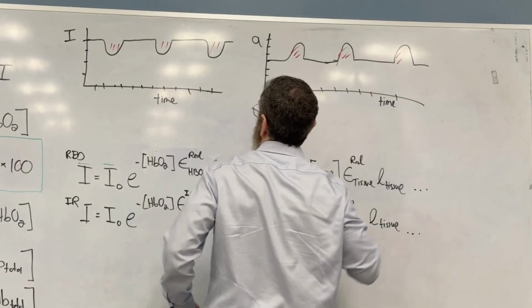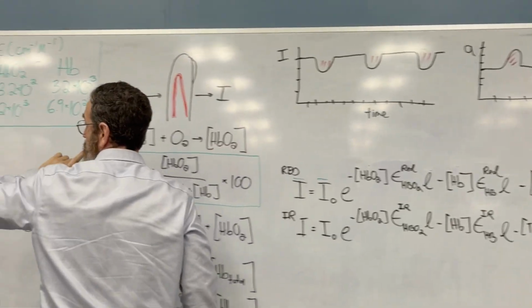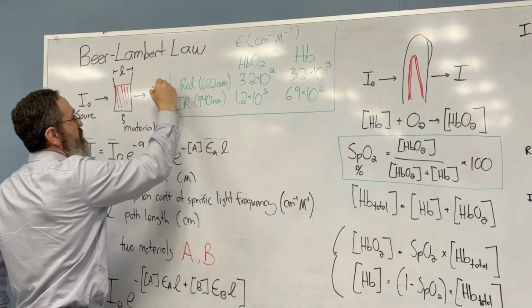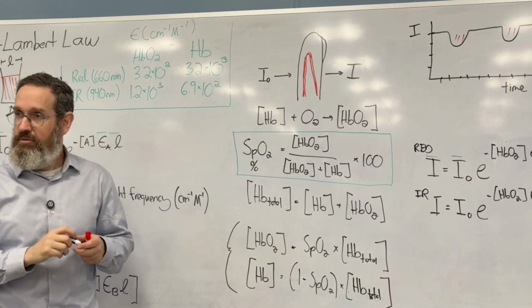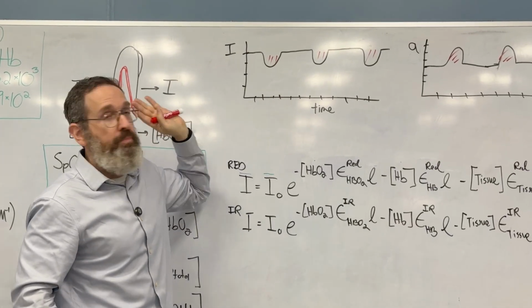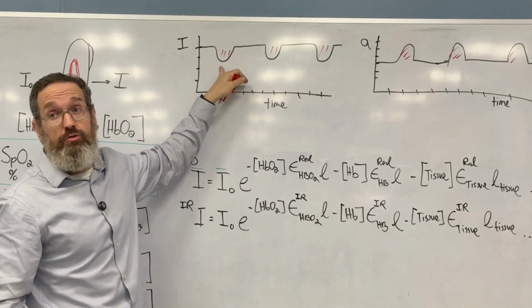This is the blood. Very nice. Now, this is the signal coming out of here. We're detecting this light. We talked about using a photodiode. So let's be clear now. This is a function of time. And let's say I wanted to just extract this. Let's just go back to the heart rate example. I've given up on oxygen, but I would like to measure heart rate.